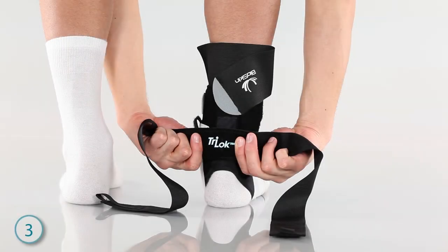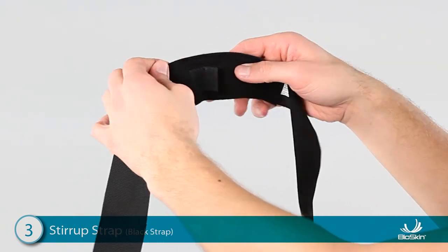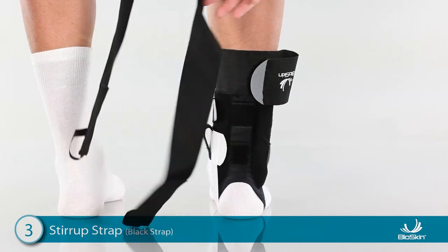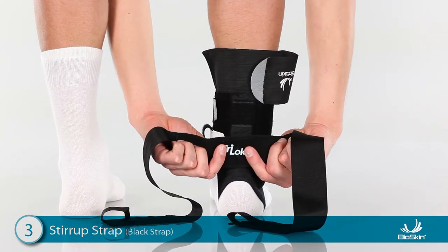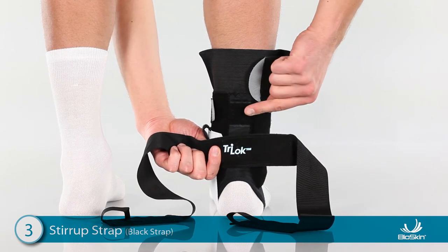Step 3: Applying the Black Stirrup Strap. Start by locating the Velcro tab in the center of the strap. Apply this tab to the back of the ankle so the straps lay to the sides. For very narrow feet, you may use the upper attachment.